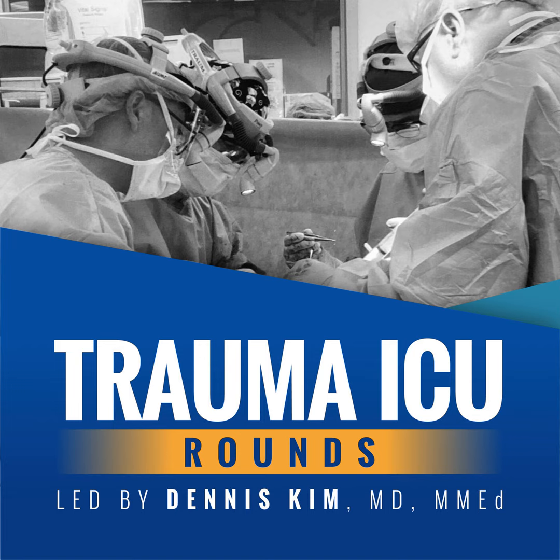So getting back to the objective at hand, let's spend a bit of time examining both volume and pressure as the targeted control variable. And as is obvious from the respiratory equation of motion, there are only 3 of the 5 variables that a ventilator can control: pressure, volume, or flow. Because only one of these variables can be directly controlled at a given time, a ventilator must function as either a volume, pressure, or flow controller. Given that flow control ventilation is really uncommon and that control of volume actually implies control of flow, remember that flow is a function of volume over time, we'll focus our attention on volume and pressure ventilation.